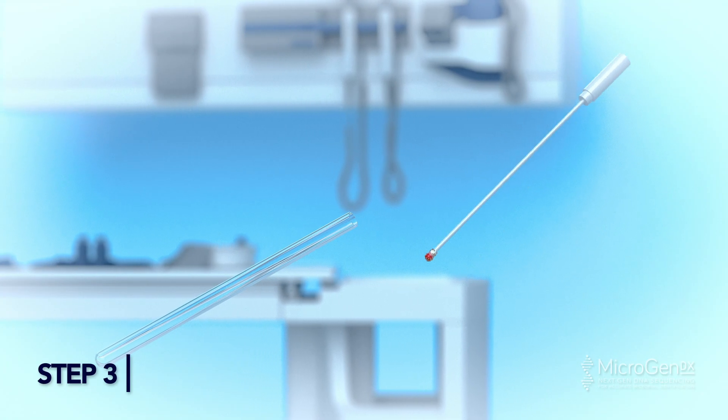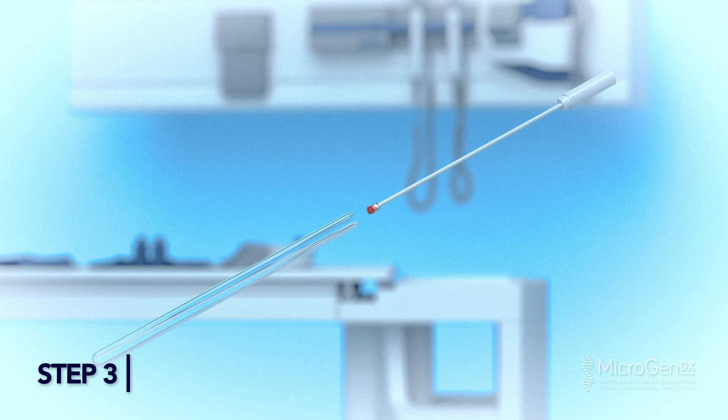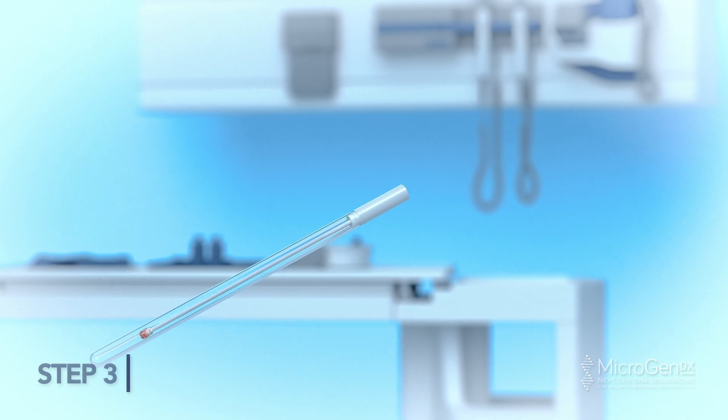Apply pressure to collect as much material as possible. To ensure optimal diagnostic reports, include solid materials in your sample. Step 3: Put the swab into the specimen tube and tightly seal the tube and/or vial.